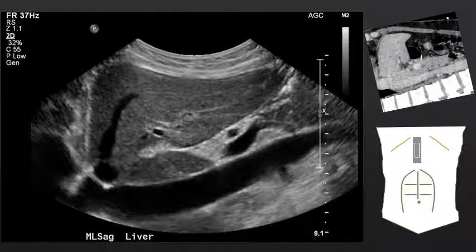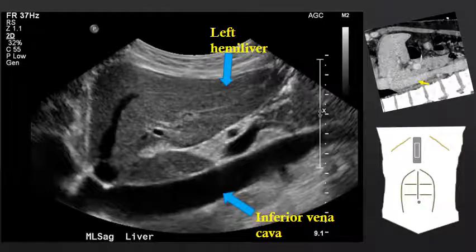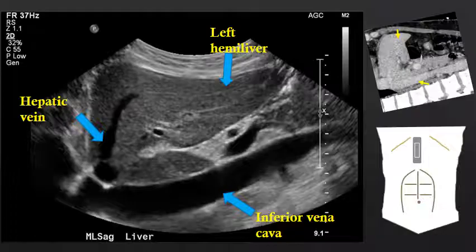If we move slightly to the right of midline, we now see another large vascular structure deep to the left hemiliver. This is the inferior vena cava. Draining into the inferior vena cava from the left hemiliver, we see the hepatic vein.